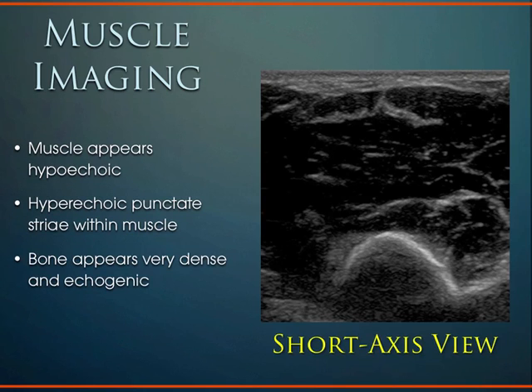That was a longitudinal view. This is short axis view or transverse or axial view, different terms for that. Again, more hypoechoic muscle structure. This is the deep bony structure here. So superficial, that is the muscle, and these are these connective tissue dots that in short axis view are referred to as kind of starry night pattern. You'll hear that term tossed around when looking at short axis view for muscle, as that starry night is just that interwoven connective tissue.